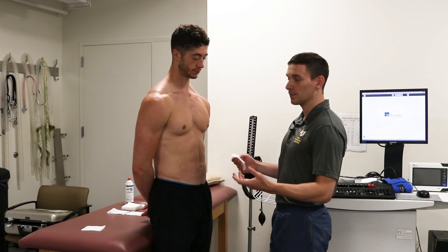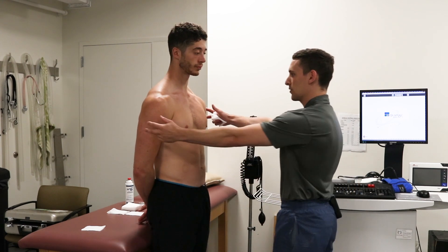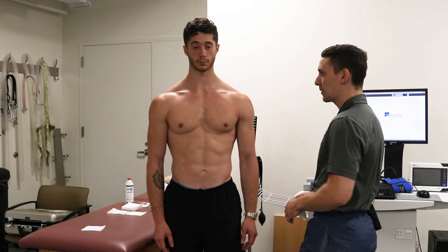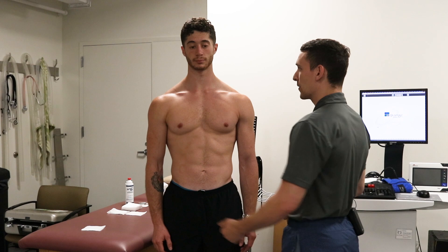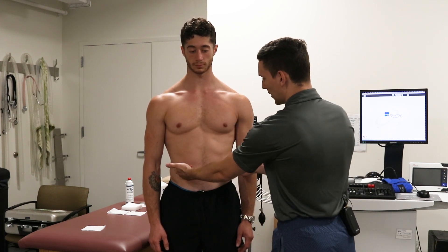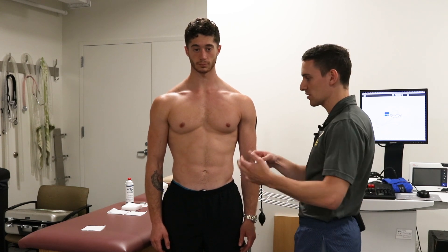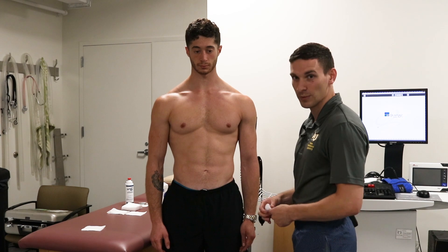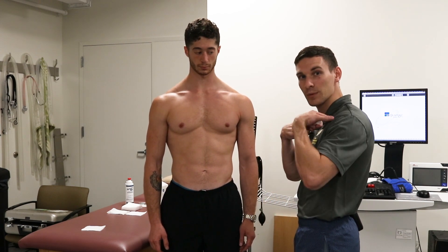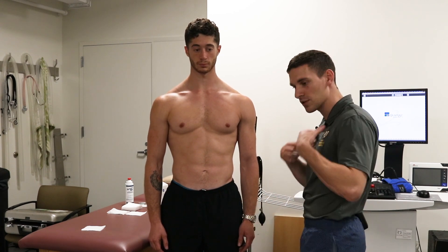The first thing we have to do is identify all of the sites that we're going to be using. The first are the right and left arm and right and left leg leads. Now in a regular EKG, if you were just sitting or lying still, the leads would actually be placed on the legs, but because we're exercising all of the leads will be placed on the torso to make sure that when we're moving around we're still getting a clear signal.